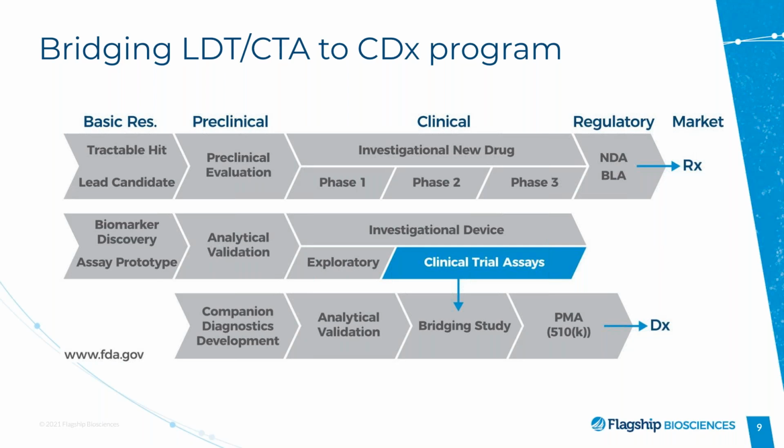We believe this trial is going to be successful, and in that case, we're starting to think about how we transition this assay from a laboratory developed test to a registrational clinical trial assay that can be run for a basic registrational phase 3 trial. And as I mentioned earlier, there are some big jumps here. One is we have to move away from research only reagents to GMP reagents, and this can take time. For us, since we are using an RNAscope assay, this does involve working some with ACD, the developers of the technology, to actually manufacture multiple GMP lots of the reagents that will be used.